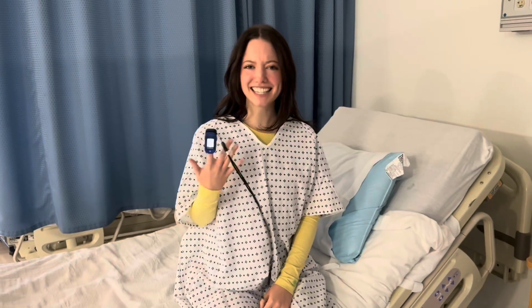Hey, what is this? Well, let's talk about it. This is a pulse oximeter. Pulse oximeters have two numbers on them, the top one being your oxygen saturation and then the bottom being your pulse. Pulse oximeters come in many different variations, but they all serve the main goal of telling you your oxygen saturation and your pulse. Your oxygen saturation is just essentially how much oxygen you have in your blood.